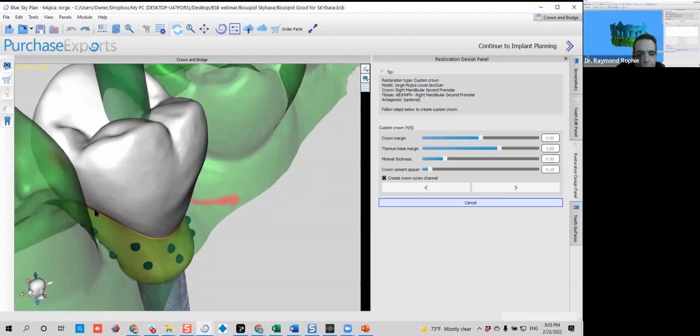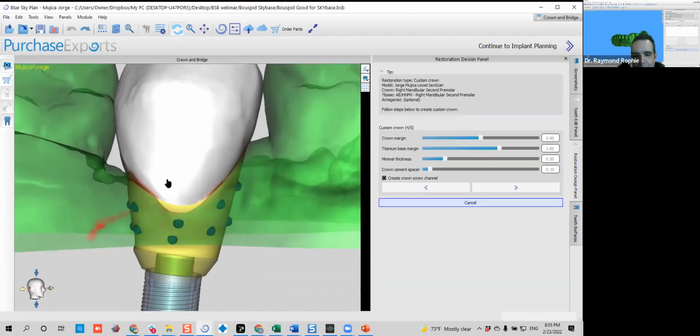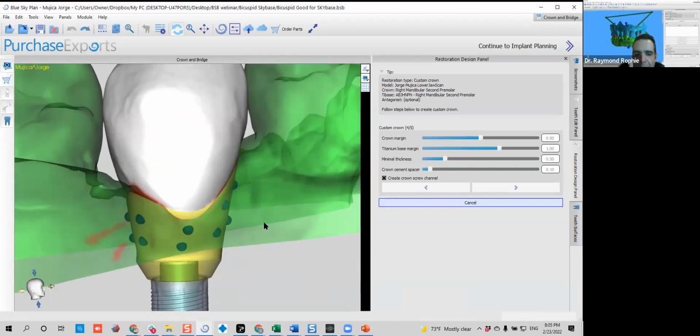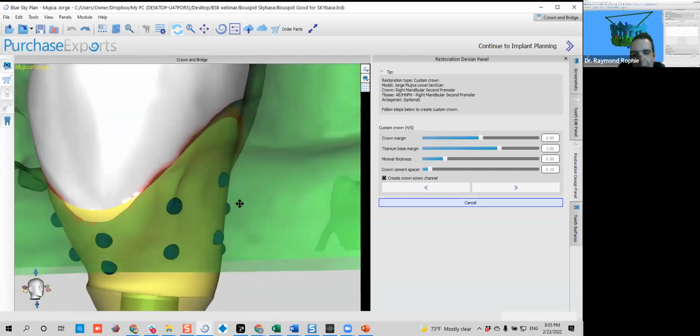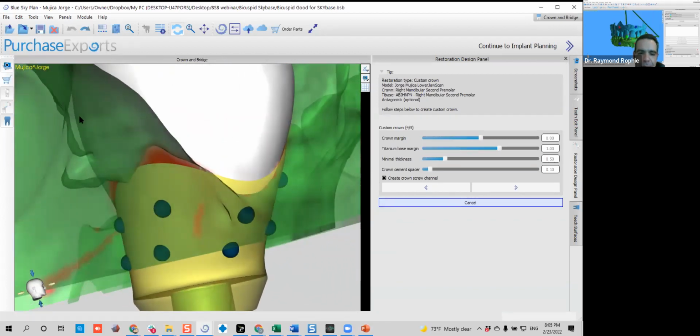Okay, good. So I have just a technique that works for me. If you have others, it will be great if you comment or ask for placing them. It will be really good to know more techniques. The way that I start working with this is I position myself in a way that I can see what I don't like.